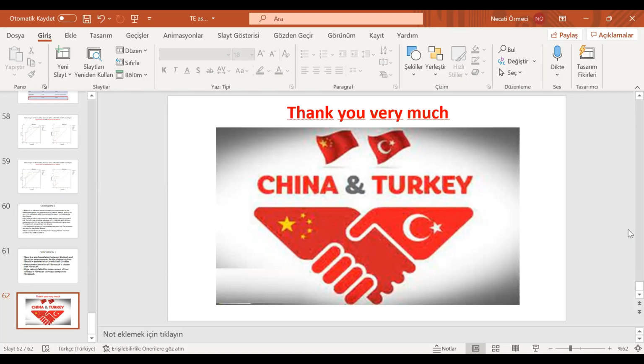Thank you. I have one question for Professor Abbas. For NAFLD, I think it's very difficult to measure liver stiffness, because these patients always have liver steatosis, and this may reduce the cutoff value of liver stiffness. Can you give some comment on how to measure liver stiffness to evaluate esophageal varices in NAFLD patients?